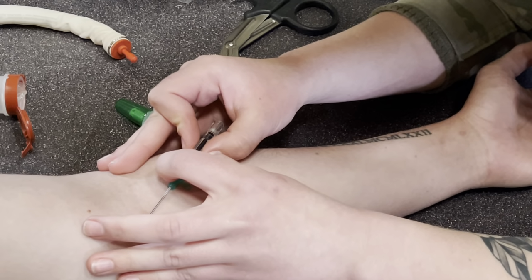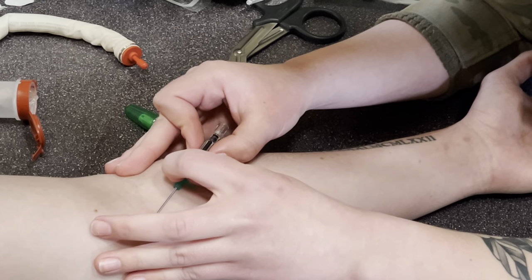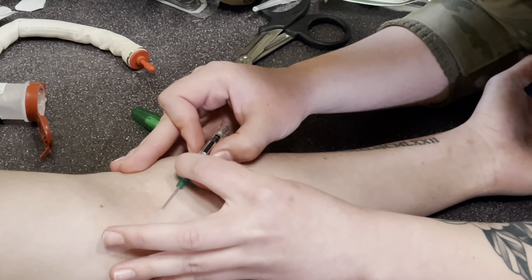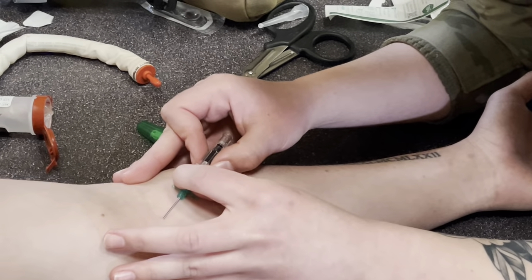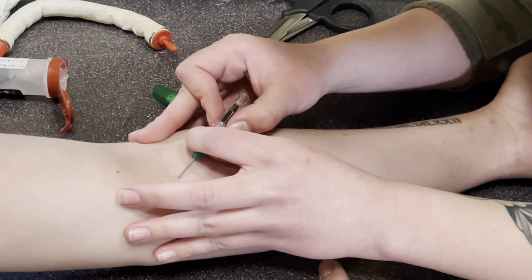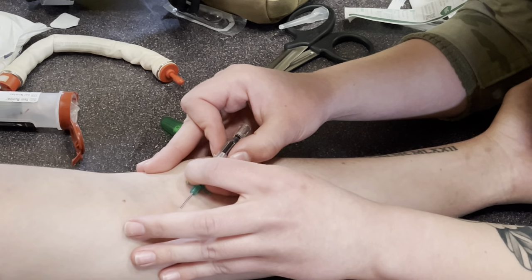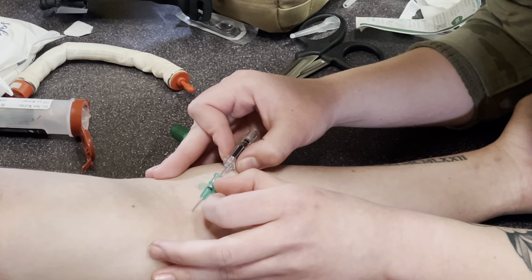If you feel resistance, go ahead and, do you feel any resistance or not? That's good, really. You got it. What about you, Hattie? Do you feel any resistance? She just got it right now. So hold on to the needle and keep pushing. Yeah. So only the plastic part's going in, the needle's not going in.